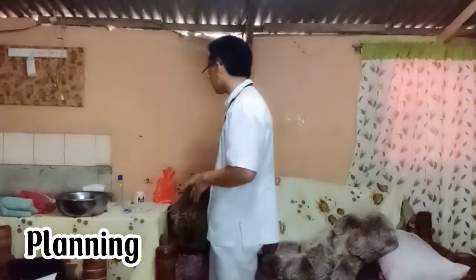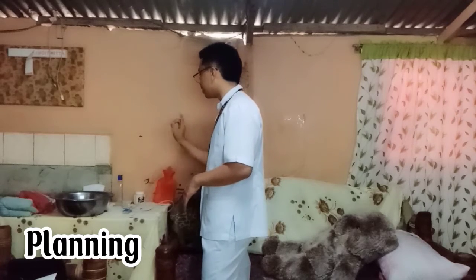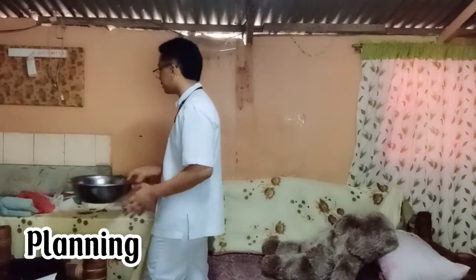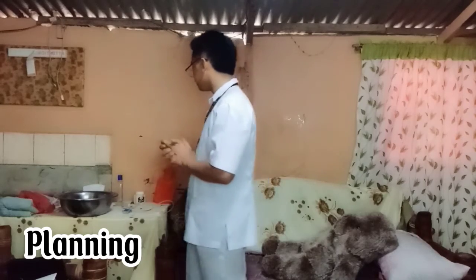Next, we're going to assemble all the equipment that we're going to use. So, we have here a rectal tube, a drainage bag, a lubricant solution, alcohol for hand hygiene, a correct amount of enema. Let's assume that it is a commode or bedpan. A paper towel, a clean towel, a blanket, and also gloves.